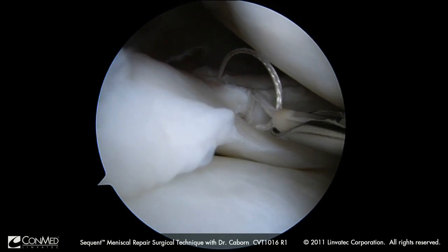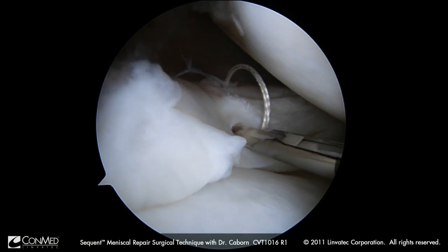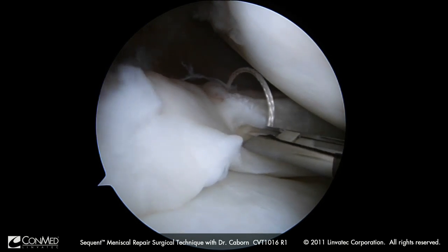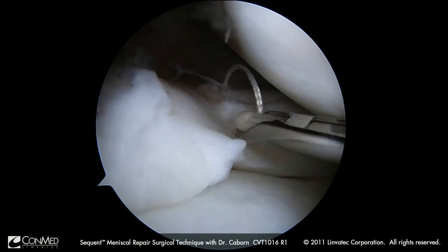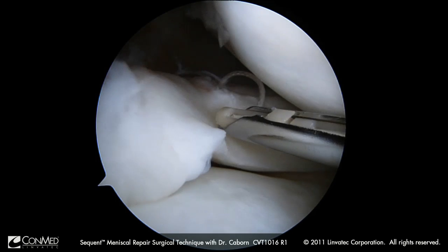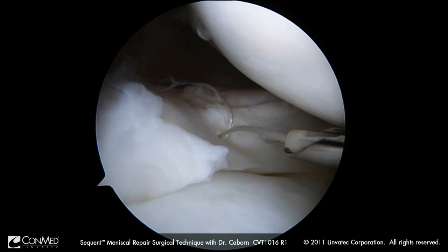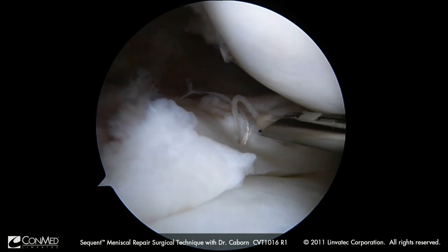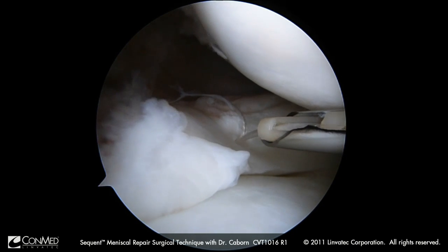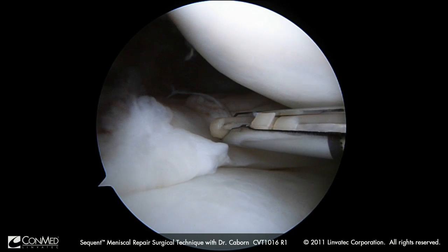I have my little ratchet wheel here — you see how it is taking the slack out of the suture. I am going to want to go right up close to where it is coming out of the meniscus so I do not have a lot of wiggle waggle in the system. Then I gradually pull on this, and you will see how this has a lot more propensity for controlling the slack. I do not have two suture strands where I am tightening one and the other is staying slack, so there is risk of puckering.